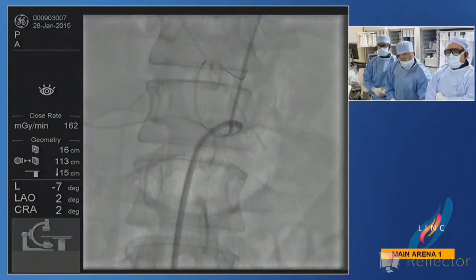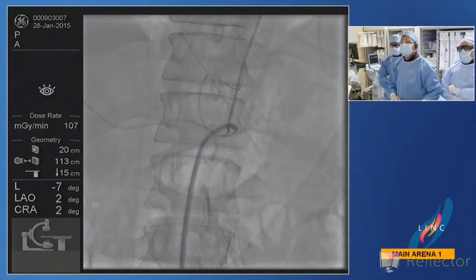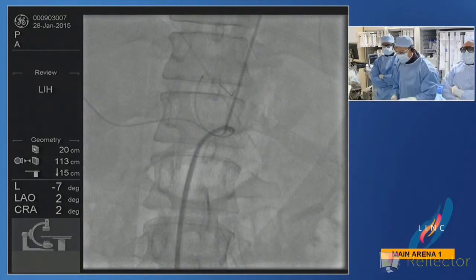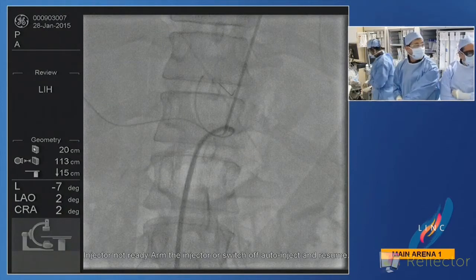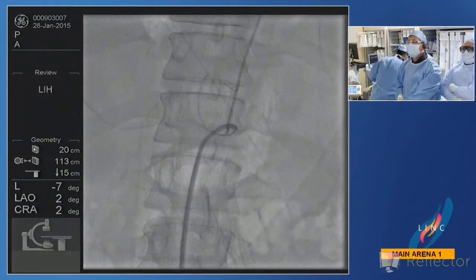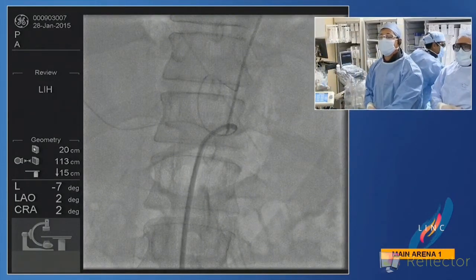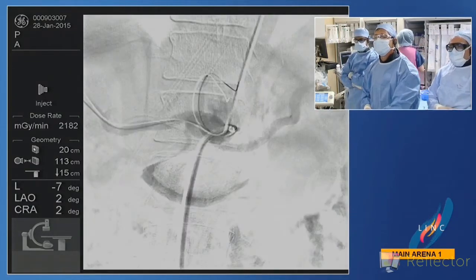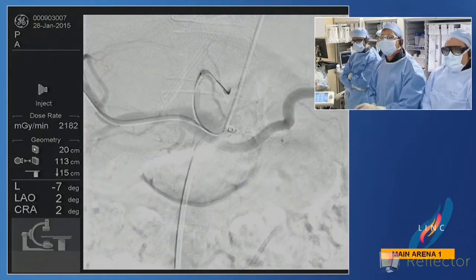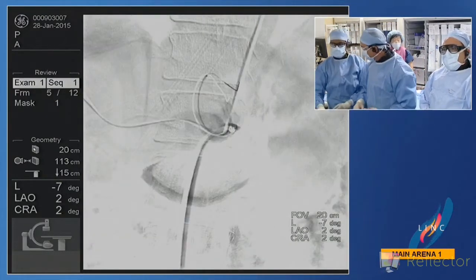So let's just get an initial view here, just an additional angiogram. Our goal is going to be to work from the top and coil that proximal to mid-splenic, as you saw. Looking at the anatomy of this, you have to turn off the injector. Looking at the anatomy of this, I think that we are going to need every millimeter of that celiac. So when we do the intervention, we'll go lateral, but we sort of started AP here. If we can play that back.